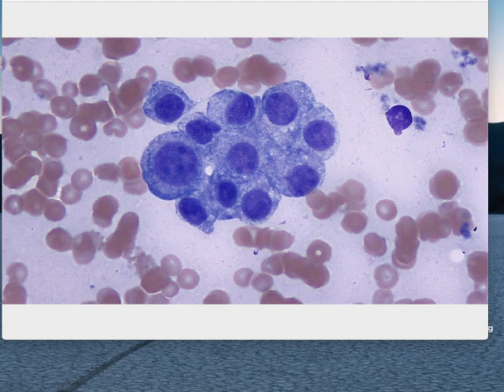If you would go to your Seurat book and open up pages 380 and 381, you're going to see a flow chart, also called an algorithm, that helps us classify effusions and solid tumors. The solid tumors on this are over on the left, so we're going to concentrate on the chart on the right-hand side. And our sample type is fluid, and then classify the fluid on gross appearance, total protein, TNCC, total nucleated cell count, and volume. And we've kind of already talked about that.